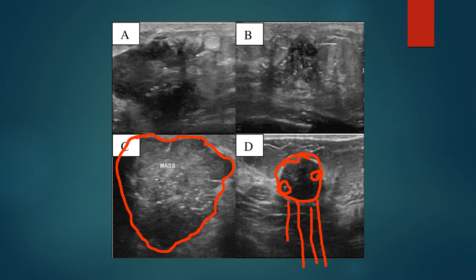We have heterogeneity here, so we're seeing different shades of gray. Same thing with A and B, different shades of gray. Here's A. We're kind of cutting it off a little bit in our field of view. And then B is actually this whole area, and it's not just the sky right here.